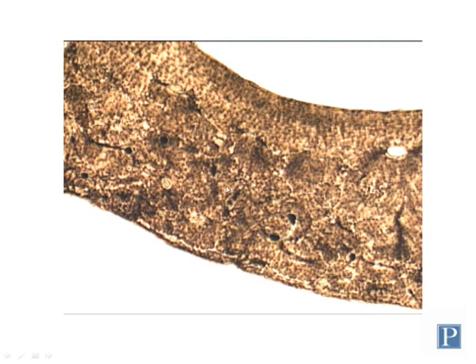One of the disadvantages, however, is that it kills all of the cells in this tissue. So when you look at bone tissue that's been prepared in this method, all the cells have died before placing it on the slide. And so there really aren't any osteocytes visible here. They've all basically died and been replaced by trapped pockets of air and bone dust and things like that. So this is a low magnification view of a compact bone that has been prepared by this method.